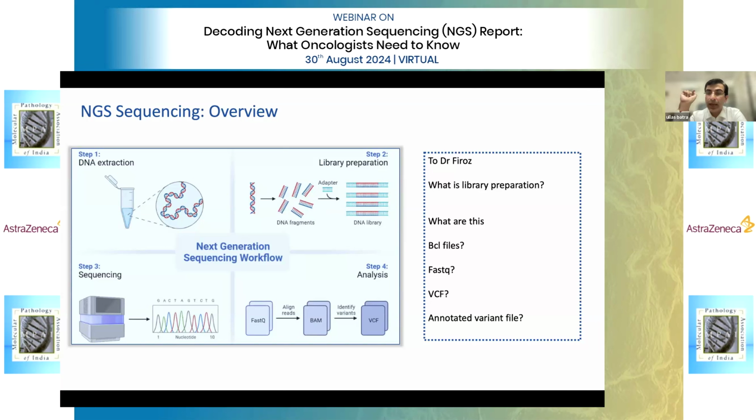I have a question. In today's era, what are the tumors in which we are doing only a DNA panel? Or as a lab, we will do both DNA and RNA, because for a clinician, it is very, very important. Vindhya, I'm sure you will agree with me, because all our fusions, at least in lung, the ALK, the ROS fusions, are basically identified better on an RNA. Yes. So is there a condition, and are all the labs doing DNA and RNA, or are there certain labs which are doing only DNA?